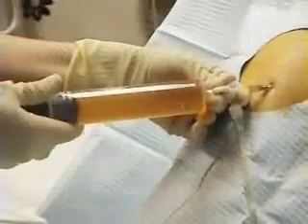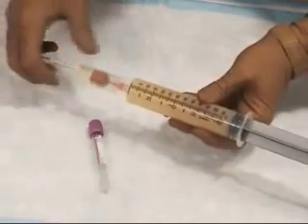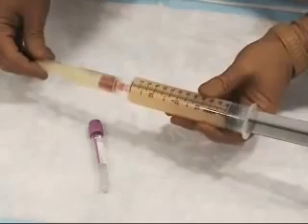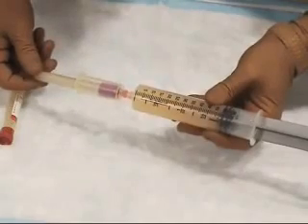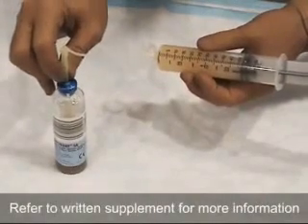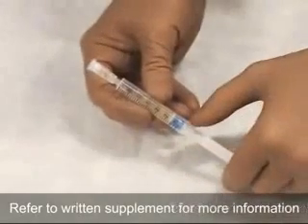Aspirated fluid should be placed in specimen tubes before the large evacuated container is filled or while it is filling. A tube without additives should be used for chemical analyses such as the measurement of lactic dehydrogenase, protein, and glucose levels. An EDTA-treated tube should be used for the cell count and differential count. Specimens for cytologic and microbiologic analyses and for other tests may be required depending on the clinical circumstances, as discussed in the accompanying written supplement.